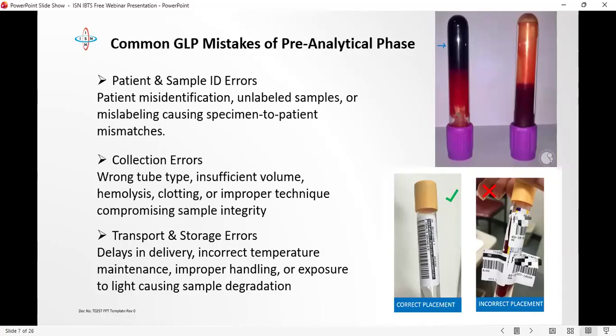So take a look at the screen. You see two different kinds of samples. The first picture there. One of the samples is clotted and the other is not. From this, which of them do you think will be good for analysis? This is an EDTA container, right? So this should be for hematology testing. Which do you think would be appropriate for testing? Please, you can unmute and answer. The one that is not clotted. Yeah, great.